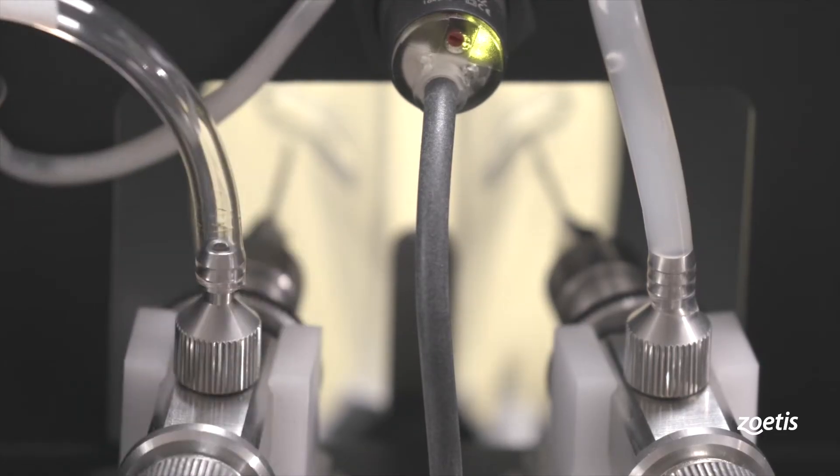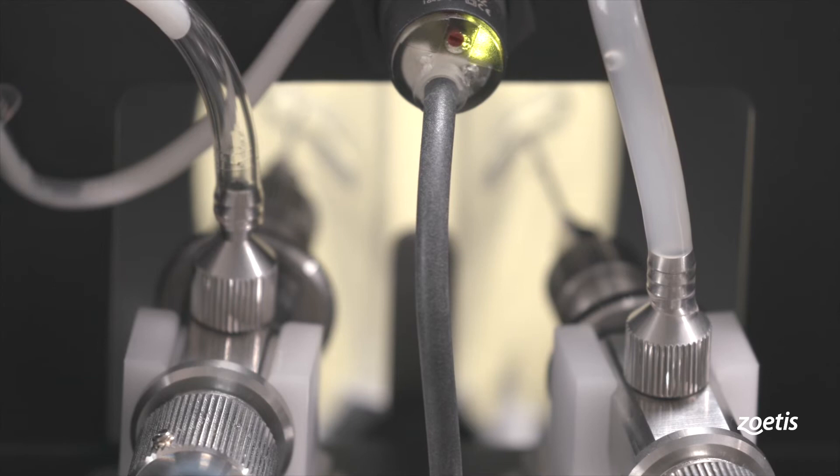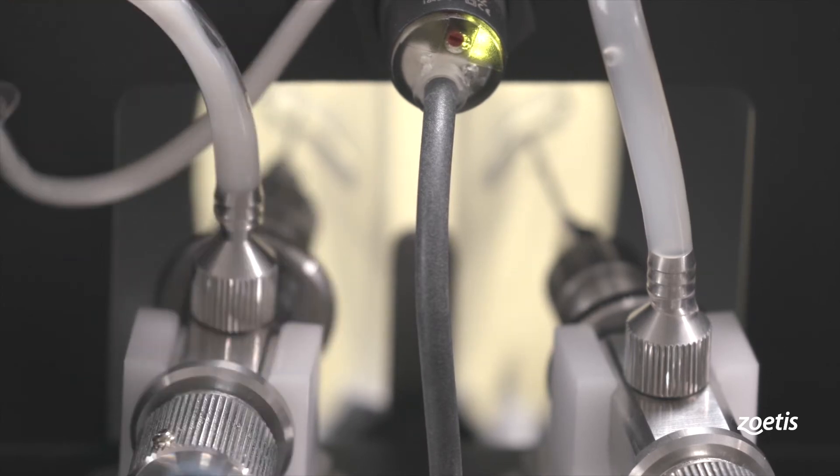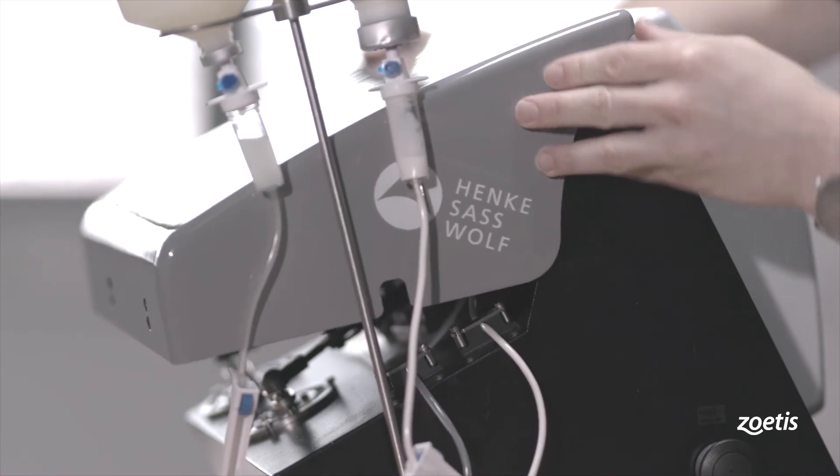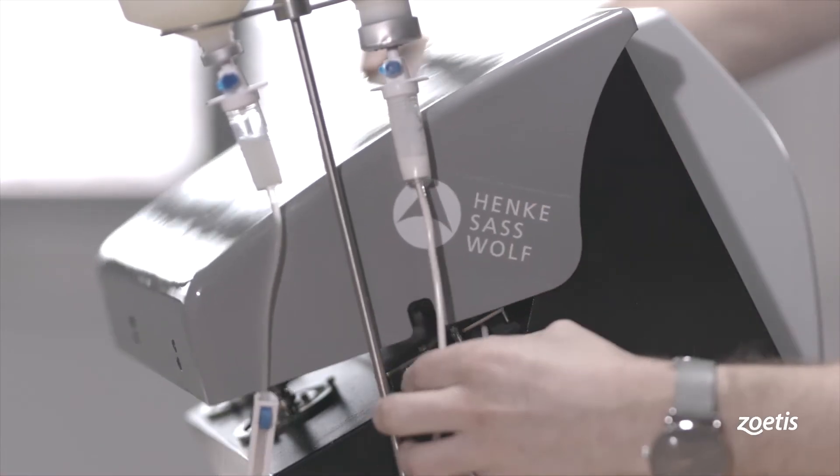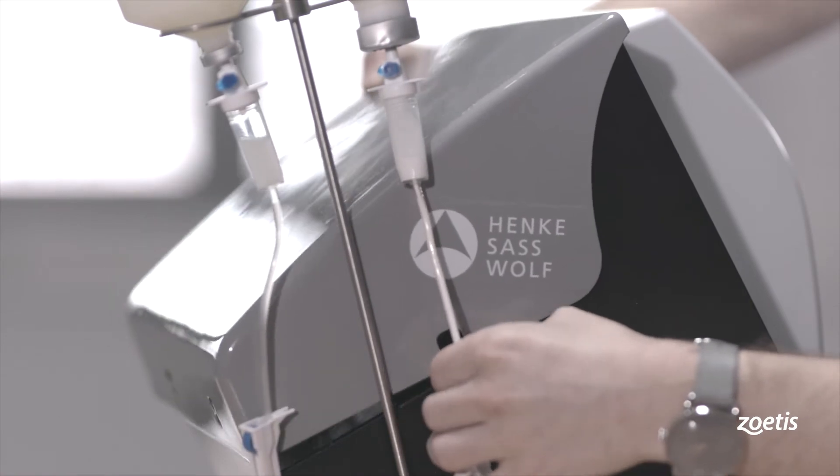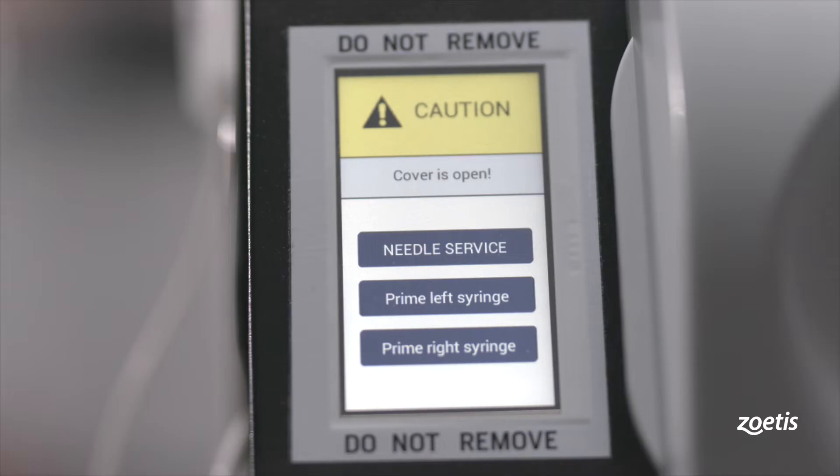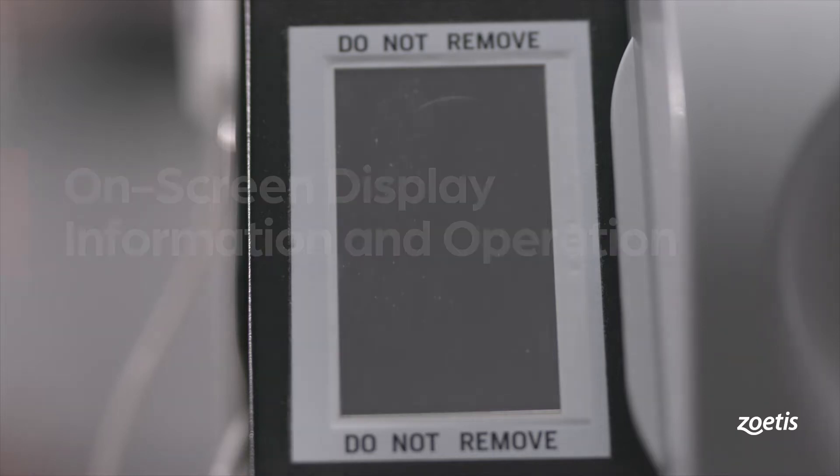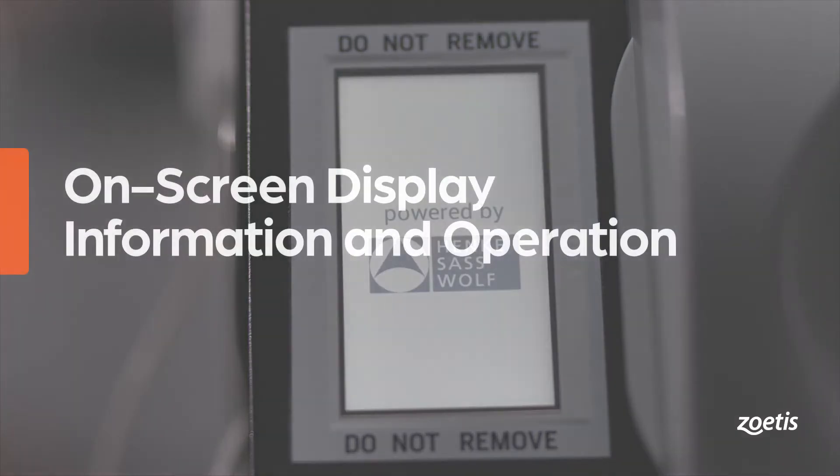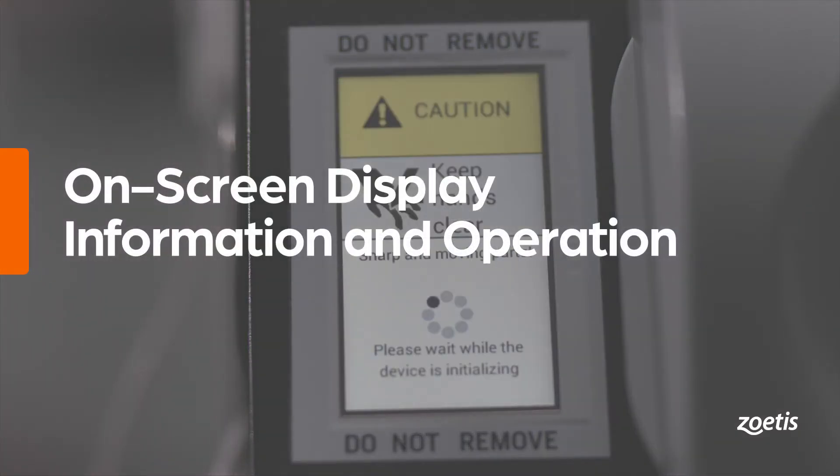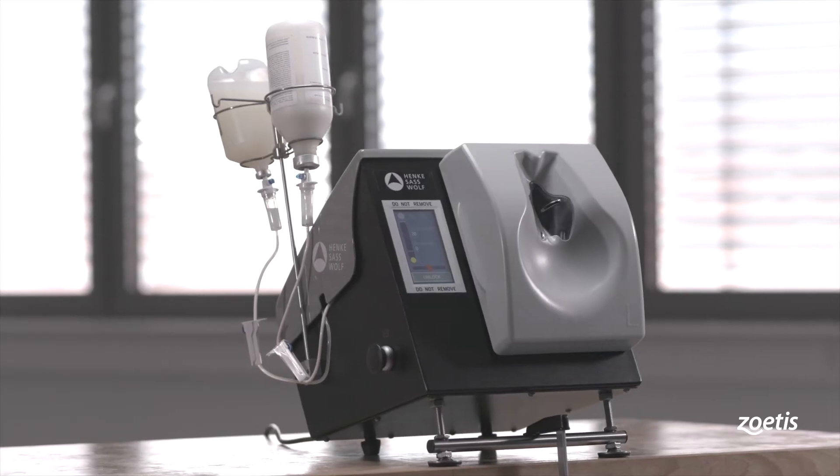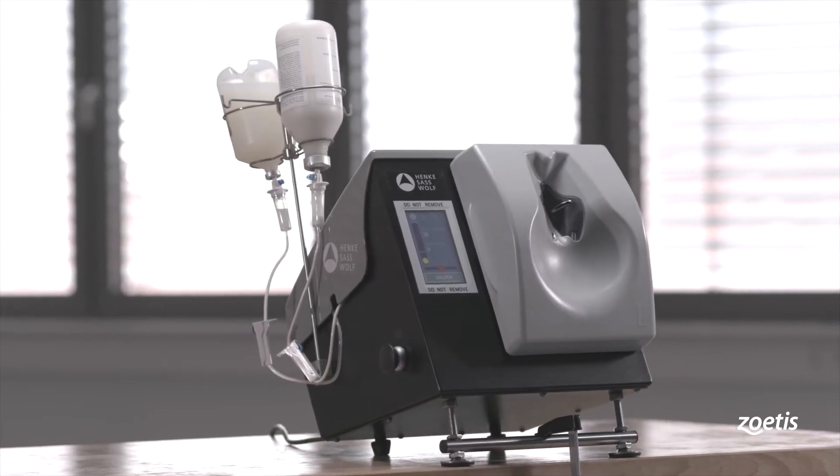The syringes are fixed doses of 0.25 or 0.3 milliliters per shot. Other volumes are available upon request. After priming, close the lid and make sure that the tubes are not jammed. Please remember that all the following settings and functions only work with a closed cover.